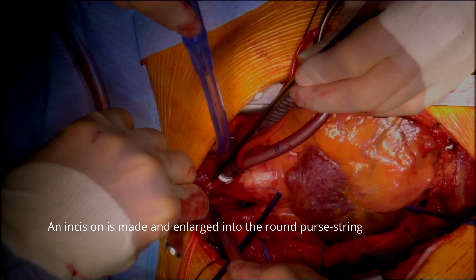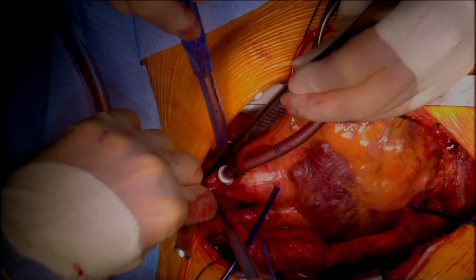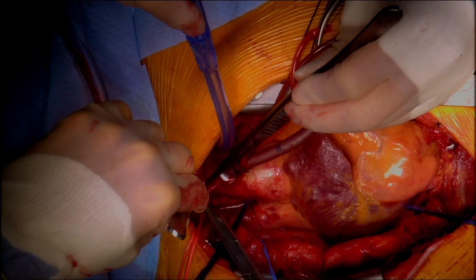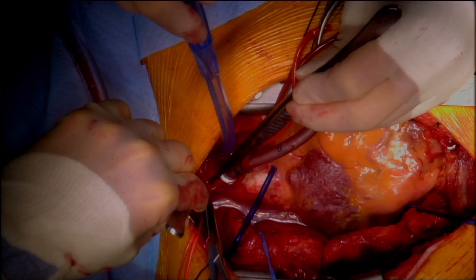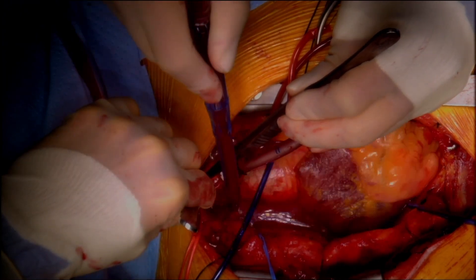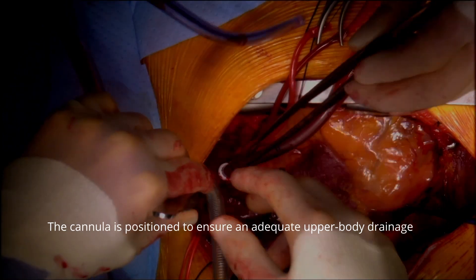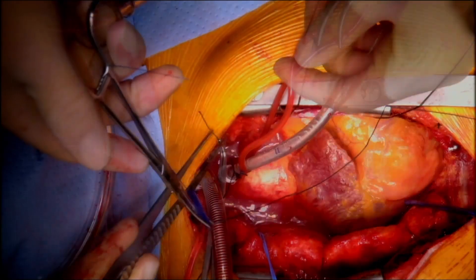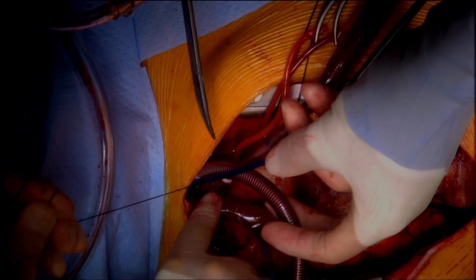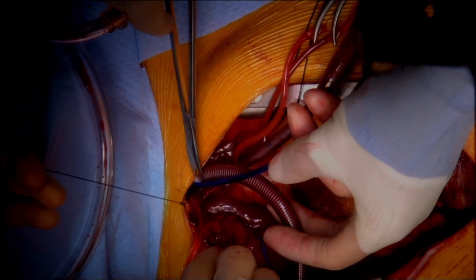The innominate vein can be used when SVC cannulation is not possible, when the SVC is inaccessible, or in hybrid or minimally invasive procedures when the femoral vein alone does not provide adequate drainage. The cannula is positioned to ensure adequate upper body drainage, and a tourniquet secures the purse-string suture around the cannula, ready to be connected to the perfusion circuit.